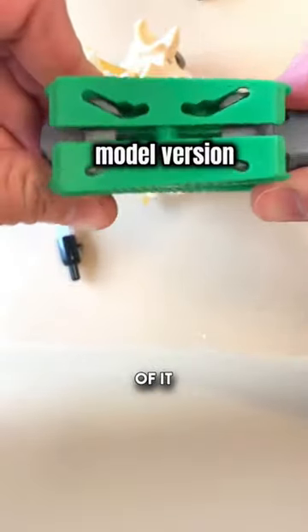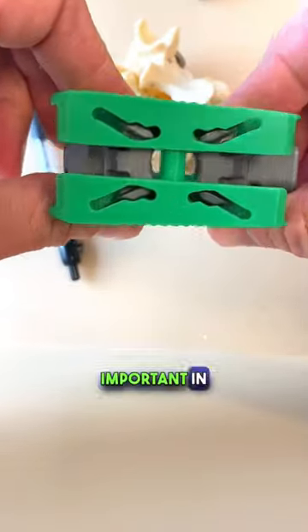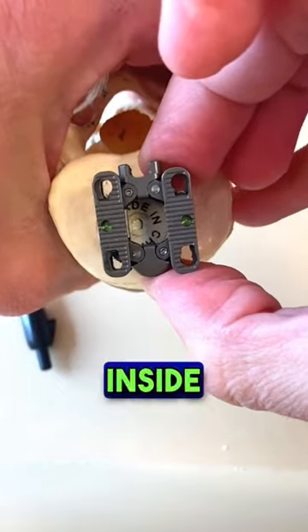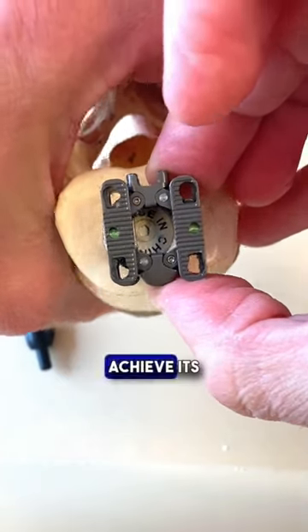Here's a model version of it. This concept is especially important in minimally invasive surgery because it allows the surgeon to use small incisions to insert small cages, and then once inside the patient, it can expand up to achieve its goal.